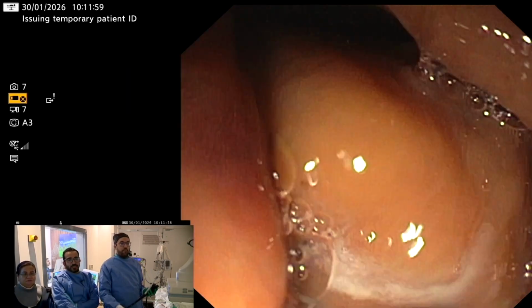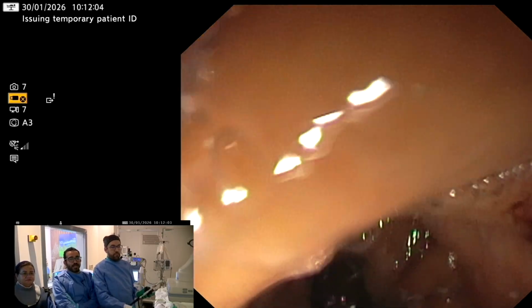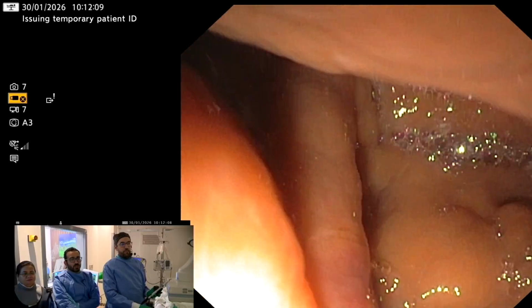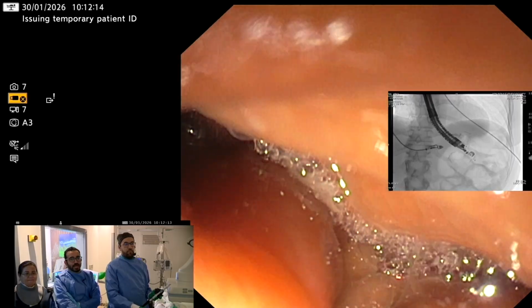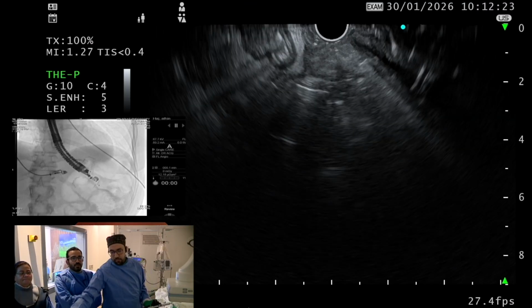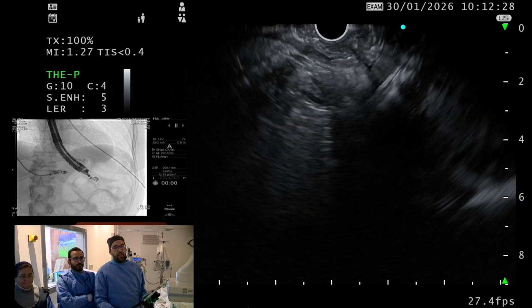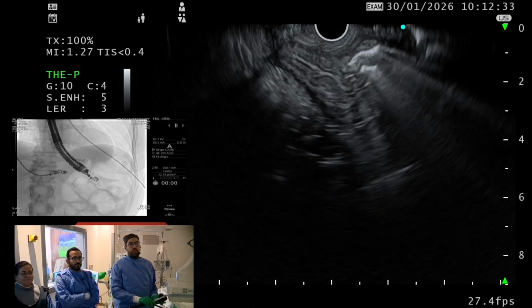So one of the challenges is that this patient underwent sleeve gastrectomy first and then Roux-en-Y gastric bypass. So we only have a small pouch of stomach with also a previous suture line from her sleeve gastrectomy, and then we have the gastrojejunostomy anastomosis for the efferent limb of the Roux-en-Y gastric bypass. We are at the pouch now and trying to look for the isolated part of the stomach. We are in the gastric pouch, which is the remnant pouch. We are trying to identify the excluded stomach, actually.